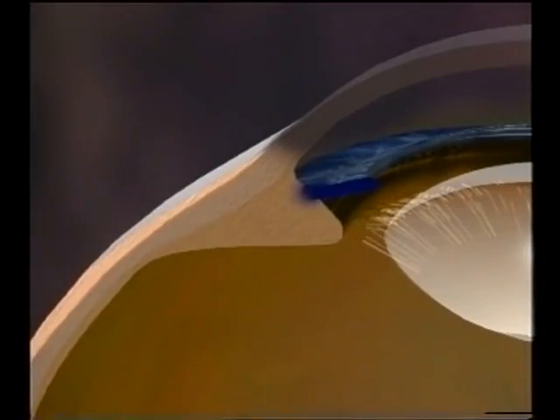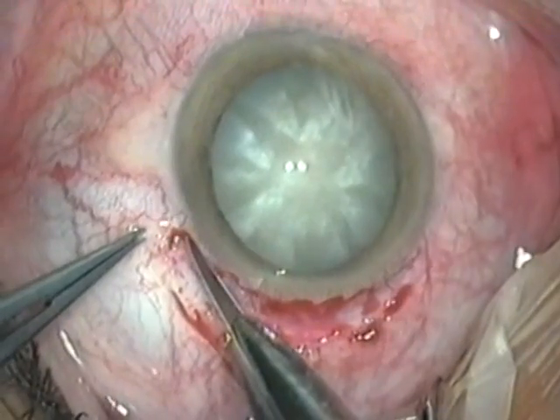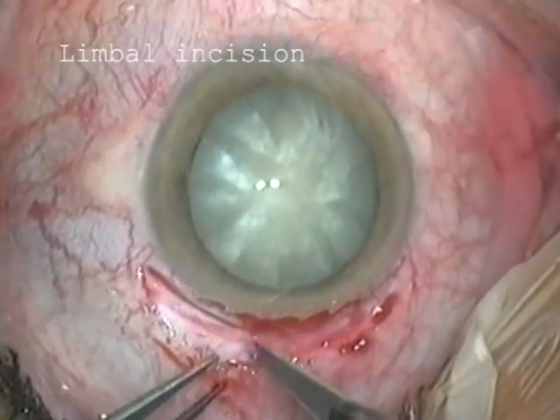A partial thickness incision is made in the sclera about 1 mm from the limbus. It's best to make the incision in two parts as shown in this diagram. First, a vertical incision is made with a scalpel or razor blade fragment halfway through the sclera.